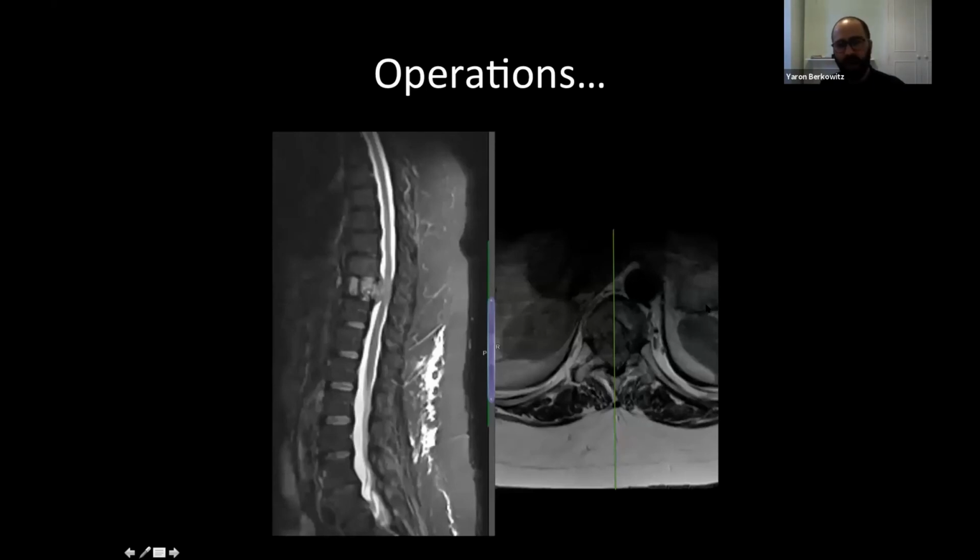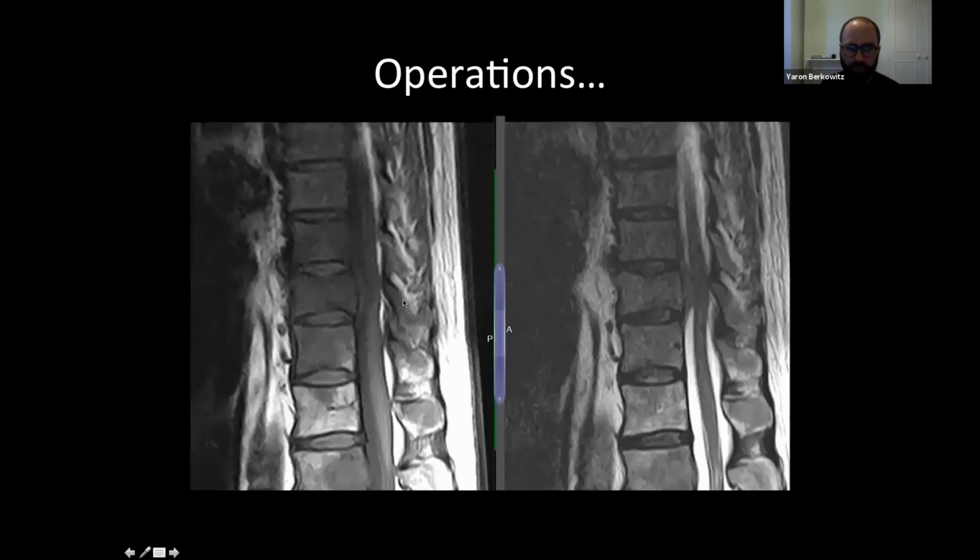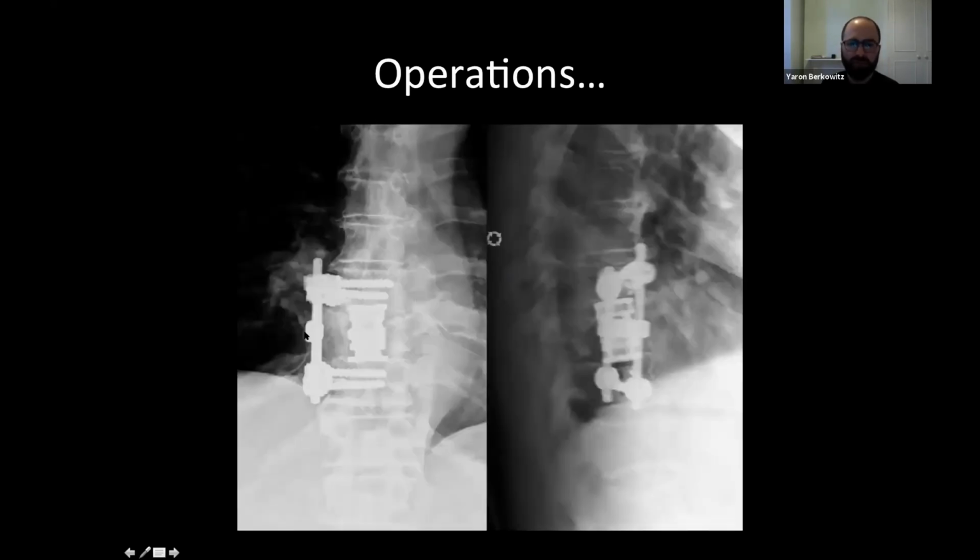As well, we have tumor surgery. This patient had a compression from a pheochromocytoma, which was decompressed, so they've had posterior decompression and fusion. Again, another patient with tumor that's causing compression or impending cord compromise. Because this is in the thoracic spine and higher up, they've done a lateral approach. Because they've come laterally, they've only fixed on one side of the spine. They can't come anterior, and they haven't come posterior because they wanted to do a corpectomy. So they've removed the vertebral body, removed that area of stenosis, and fixed it.